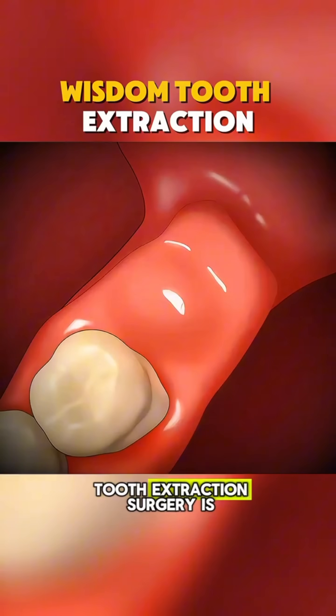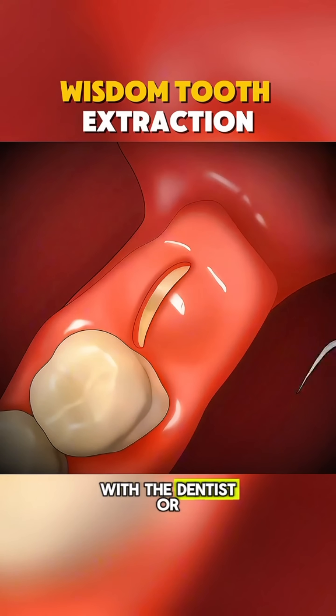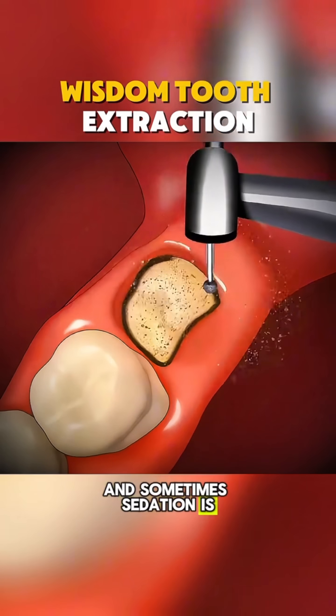Ever wondered how wisdom tooth extraction surgery is actually done? The procedure typically begins with the dentist or oral surgeon administering local anesthesia to numb the area, and sometimes sedation is used for comfort.